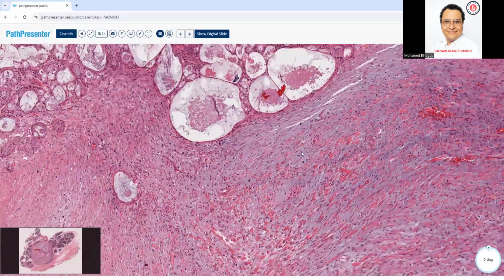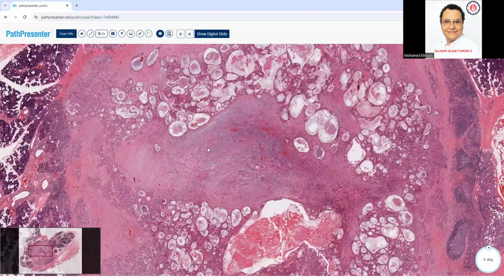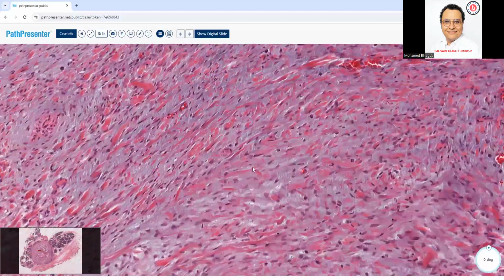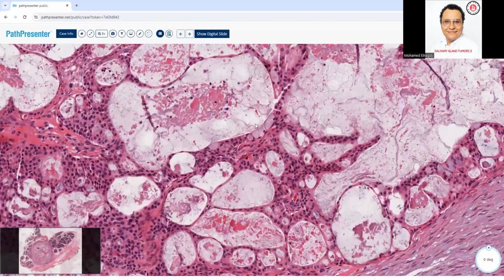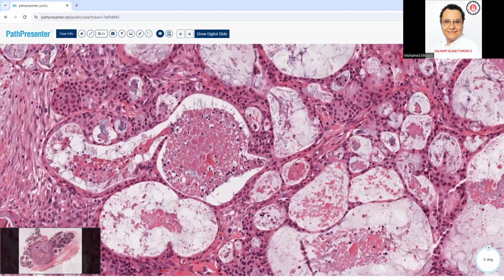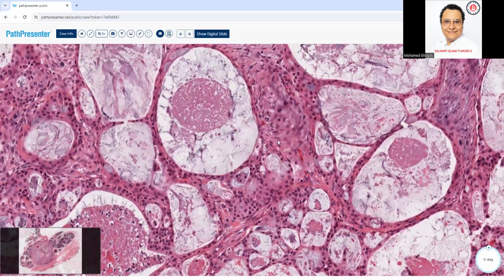Yeah, I kinda heard it in your description. Well, I see an area here which has some spindles. It's not in the surrounding of the tumor, it's right there in the middle. Well, possibly, yeah. But when you look at these, they're not really cystic areas, which would disqualify it a little bit from pleomorphic adenoma.